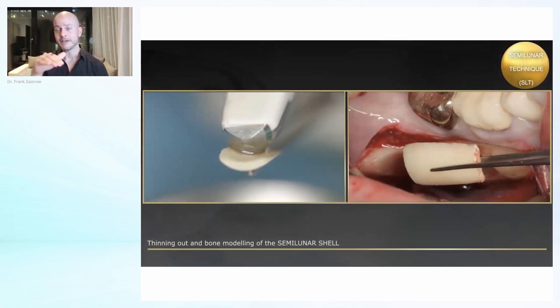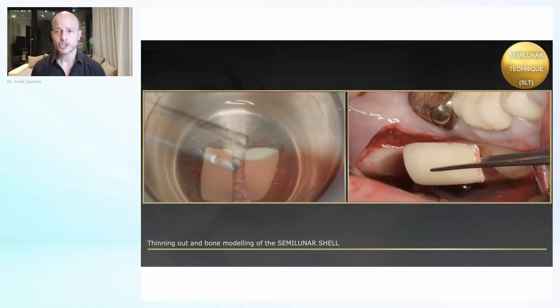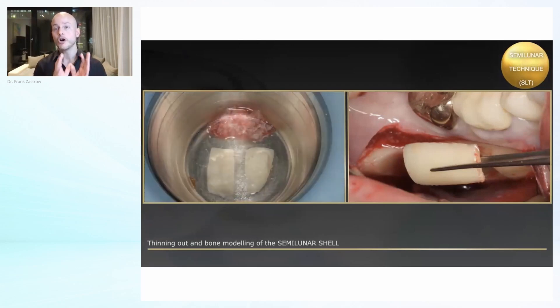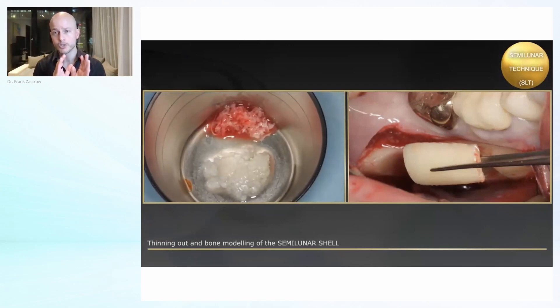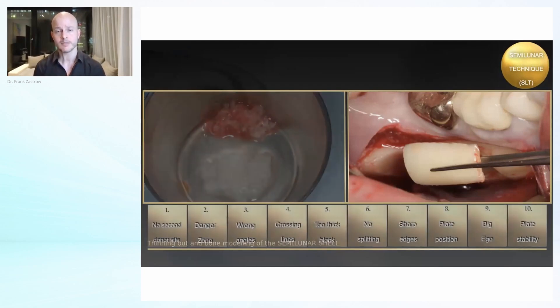You see here, after scraping, you really have this nice rounded form. You will now see the chips partially collected from the shells, which are more white. Make sure that your shells and your chips are always stored in saline.